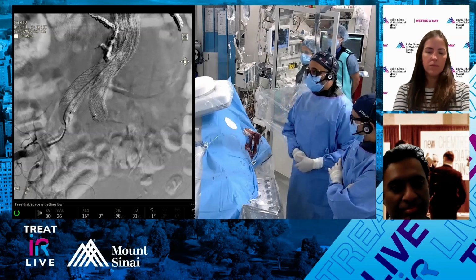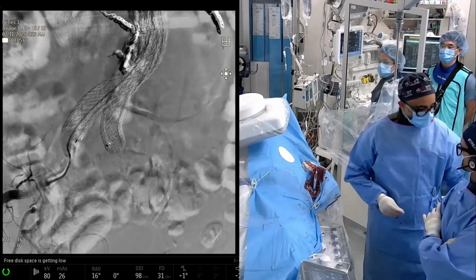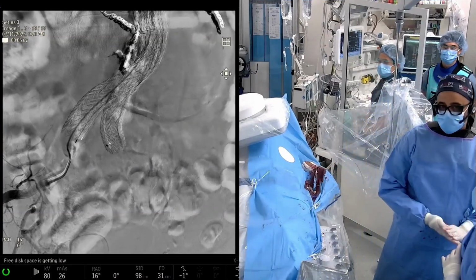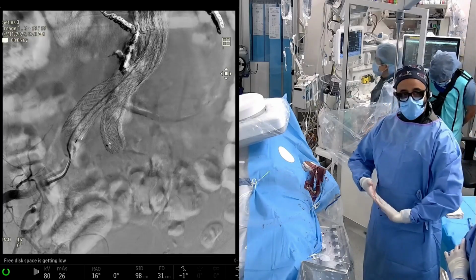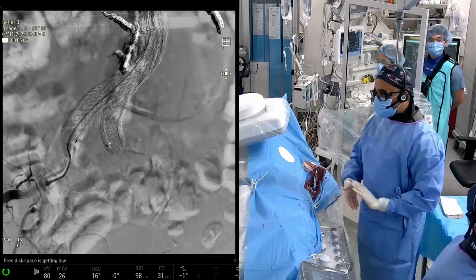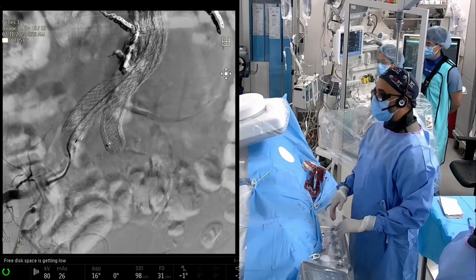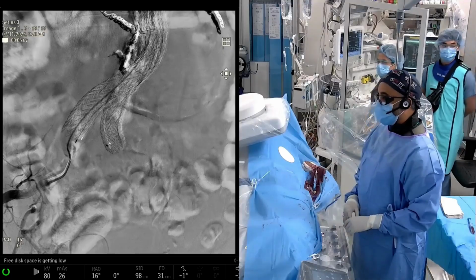Yeah, the coils for Penumbra are sized a little differently. They're supposed to be 1-to-1 sizing for the pods because it's a relatively stiffer coil. So we're going to take an 855 pod. There is an 870. The only reason is I don't have a ton of experience, and I'm a little worried because it's not a super long hypo, so I'm a little worried about the length. So I can always put an extra coil.